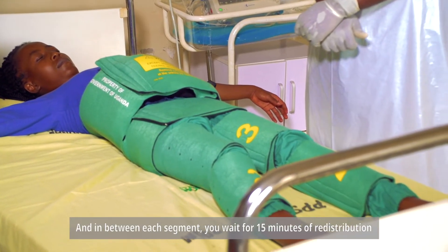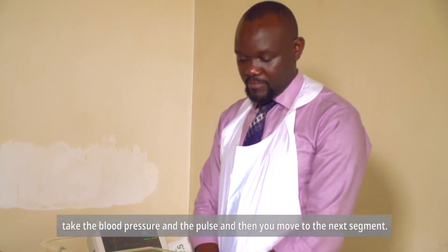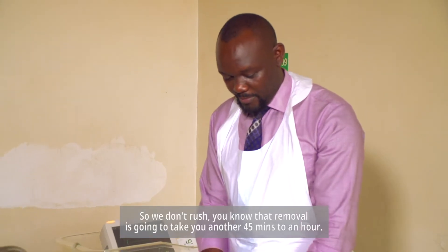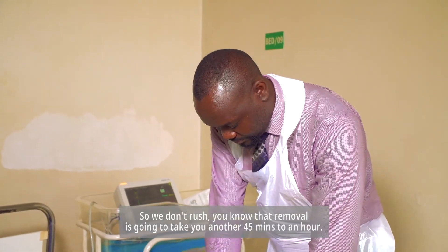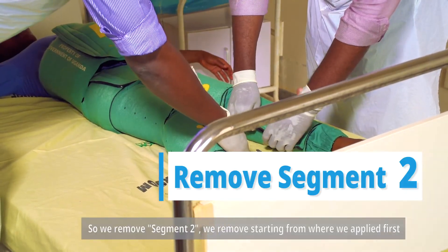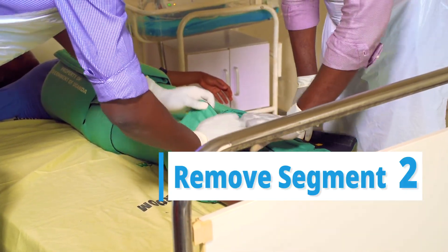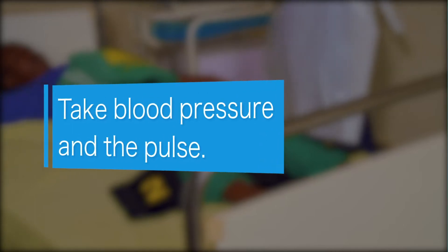In between each segment, you wait 15 minutes for redistribution, then take the blood pressure and pulse, and then move to the next segment. We don't rush — removal is going to take another 45 minutes to an hour. We remove segment two first, starting from where we applied first. We wait 15 minutes, then take our blood pressure and pulse.